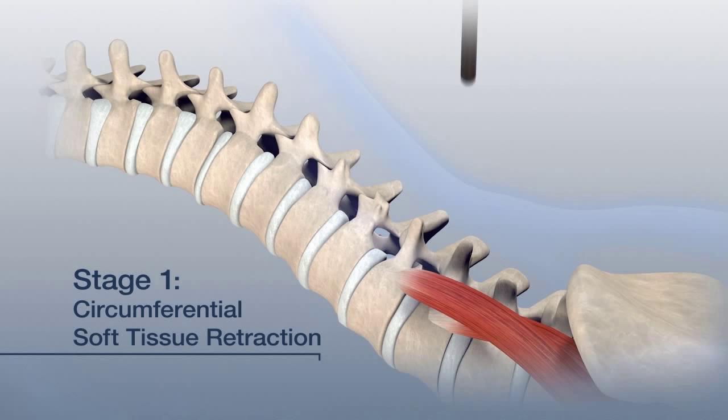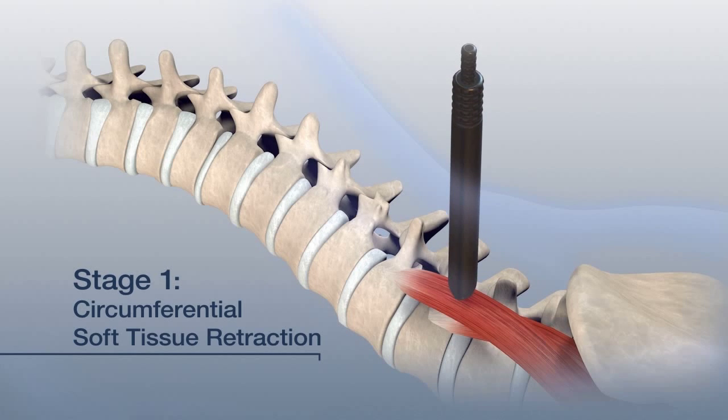Insert dilator A down to the psoas muscle. Confirm positioning with fluoroscopy. Sequentially, insert dilators B and C.